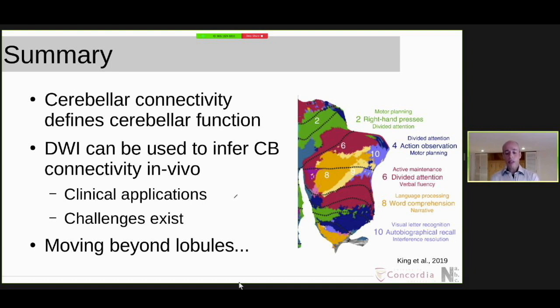As I said previously, if you can do this type of classification where you segment out regions, that can be very easily used to compare different patient populations. And some of the techniques that Paul Noel is working with to try to segment out the MCP could be super useful for identifying surgical approaches and that sort of thing, for example, for cerebellar mutism patients.